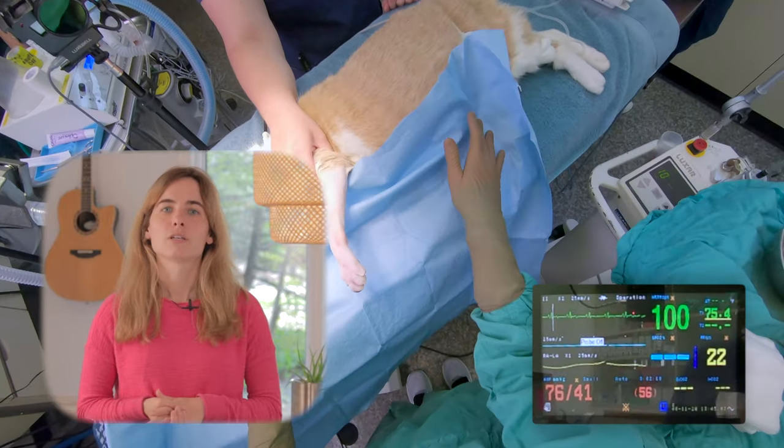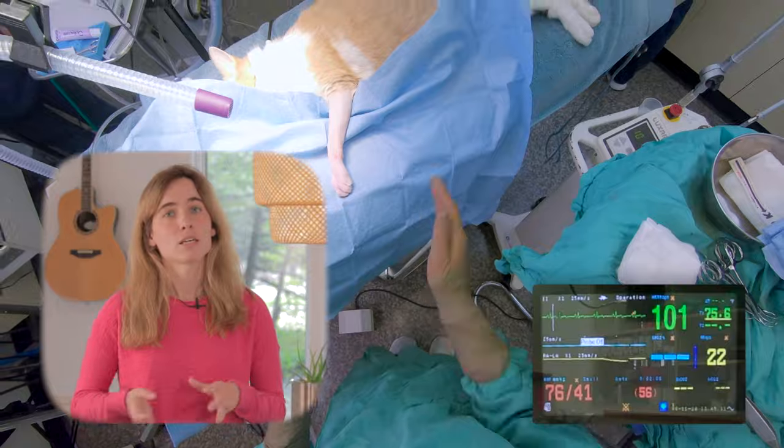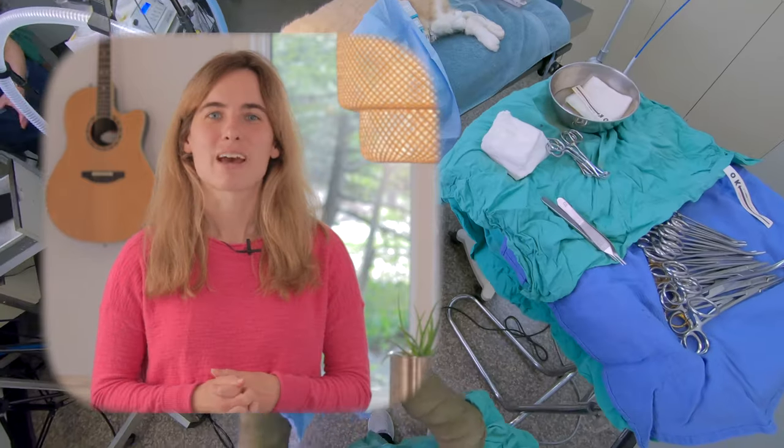It's a monitor that we primarily use in order to look at different aspects of the cardiac system. One of the key things that it does is monitor blood pressure, and that's going to be what we focus on today. I'm Dr. Megs and this is Everyday Vet.